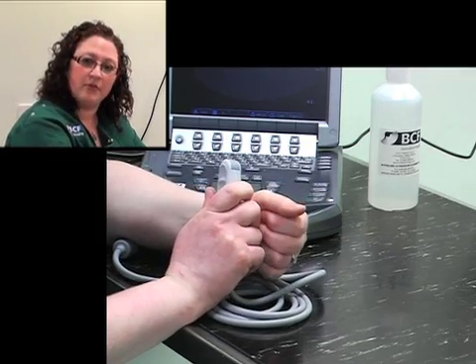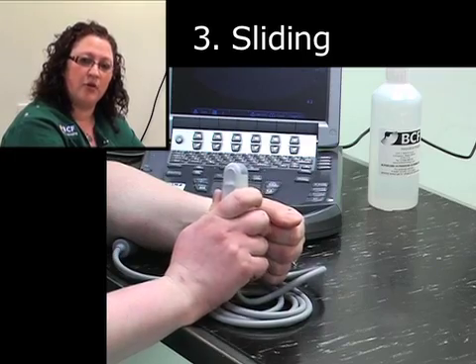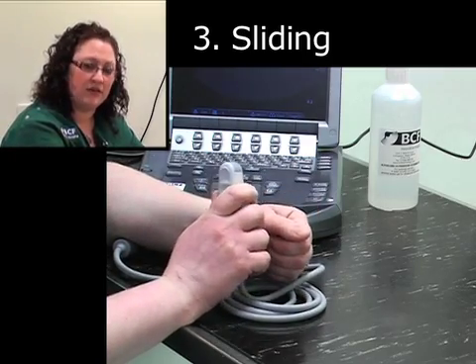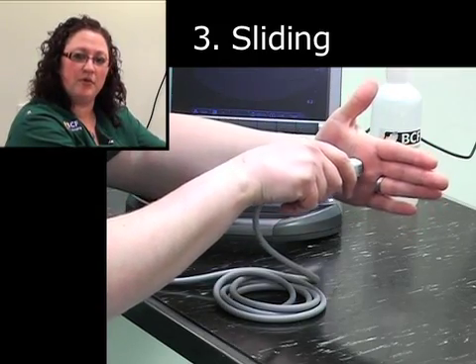A third movement that you can do is sliding. Sliding is where the surface of the probe actually does move along the patient. It's exactly what it sounds like. You slide the probe in one direction.